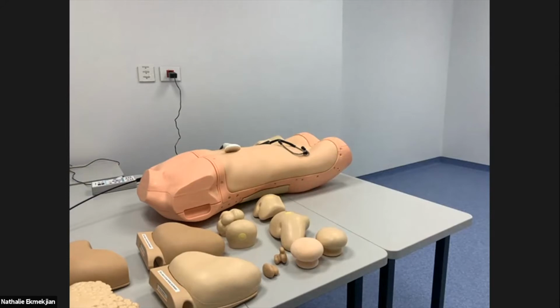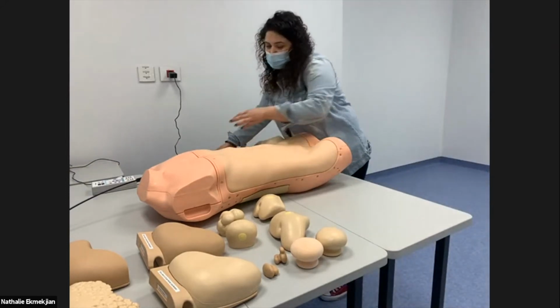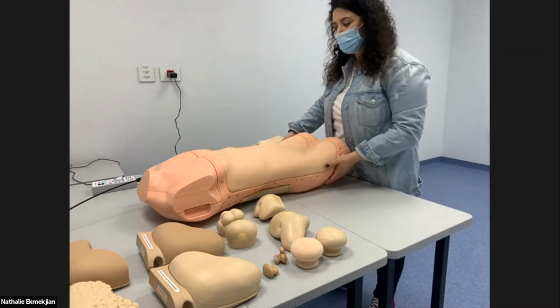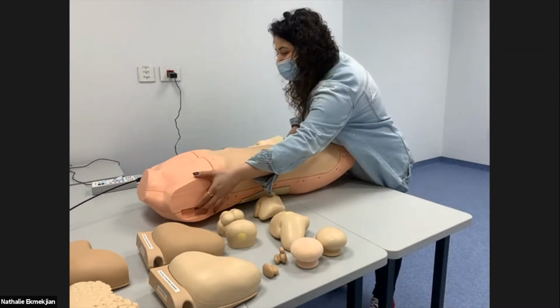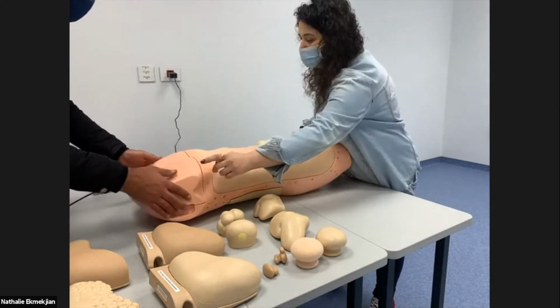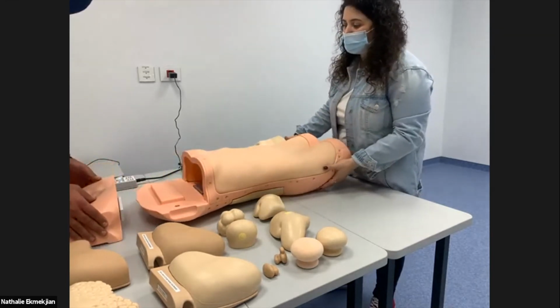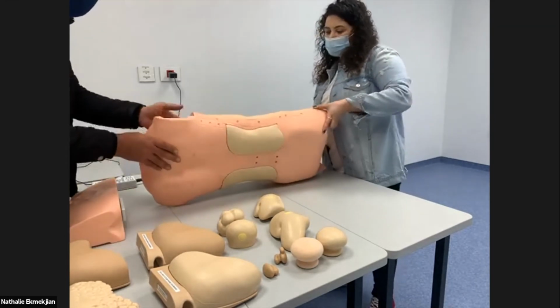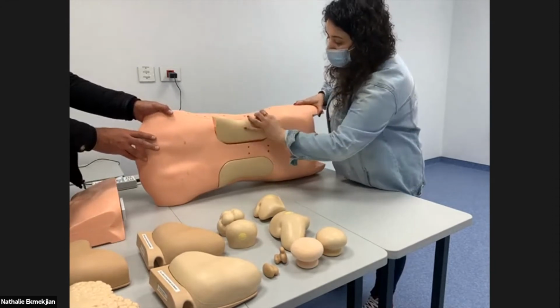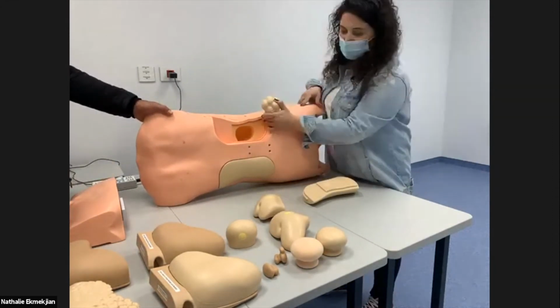The second part, how to put the interchangeable modules. We can lift it, open, and put one of the kidneys.